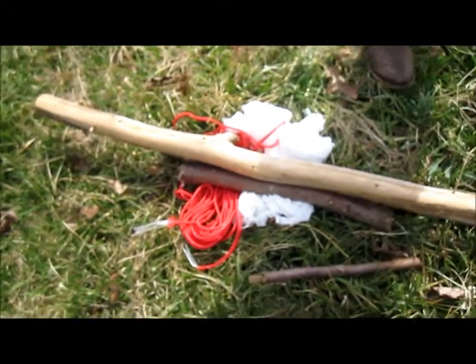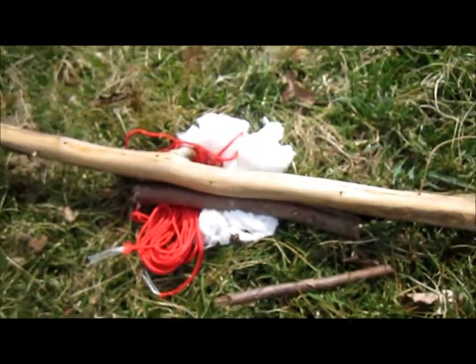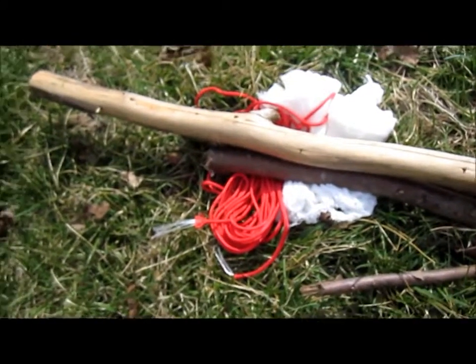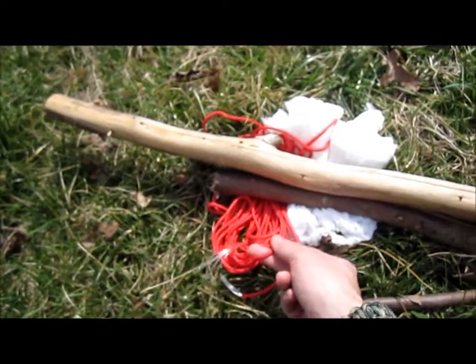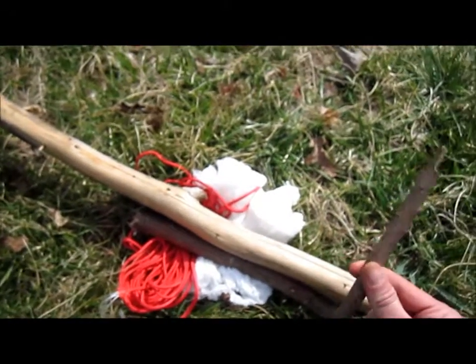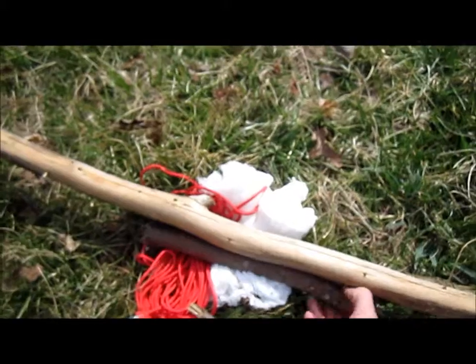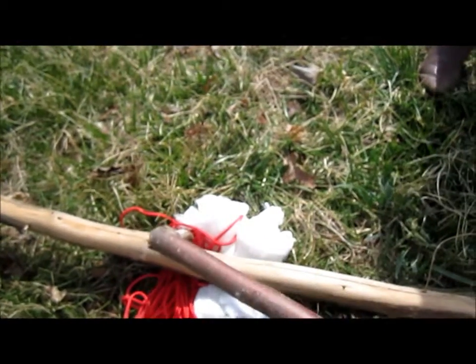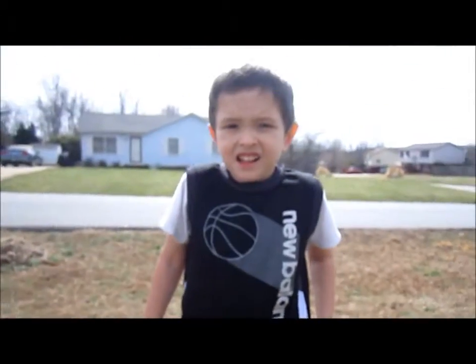We need two sticks, and I'll explain the length on those in just a minute. Something to pad under the arm and under the groin with. A rope or something to actually tie the traction splint to your patient's body. Another stick to twist with. You've got right here a cross stick or cross member, whichever you prefer. And, of course, a willing patient.